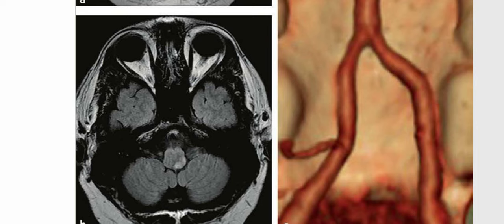So the key finding here is of abnormal increased FLAIR signal along the posterolateral medulla, along with the absence of PICA on the angiography image. So this is a case of lateral medullary syndrome or Wallenberg syndrome, which classically results from the occlusion of the posterior inferior cerebellar artery, that is PICA, with associated infarction of the posterolateral medulla.